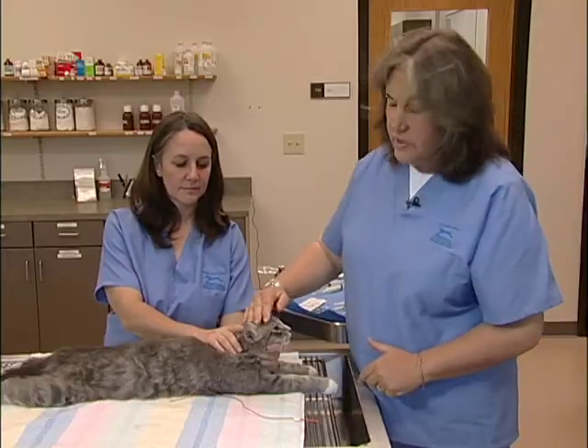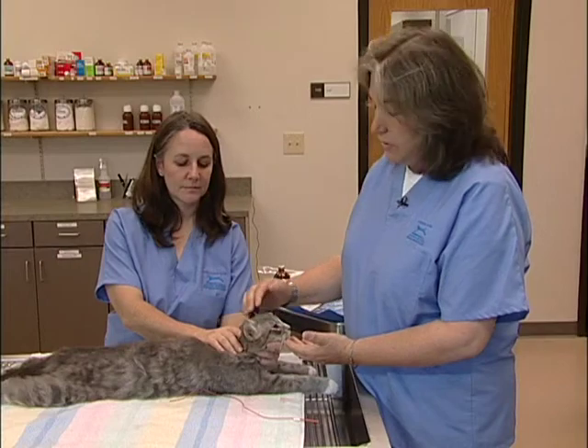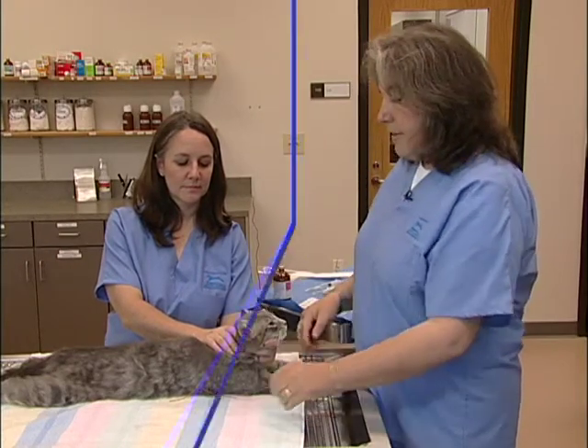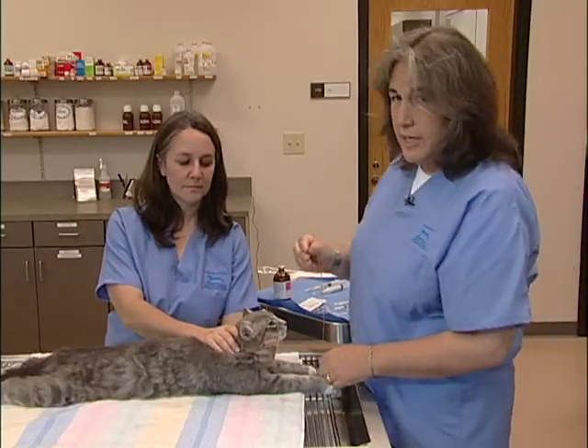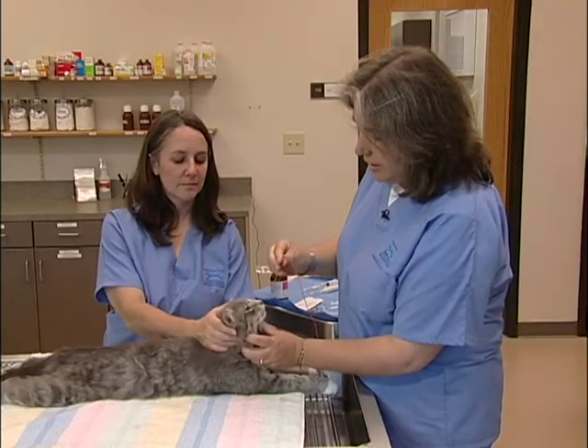Now this cat is a little bit sedated. You don't have to sedate the cat if the cat has a nice temperament — you can do this technique on a cat that's perfectly wide awake. After 5 minutes, I'll take the catheter and dip it in some KY jelly to facilitate the passage.